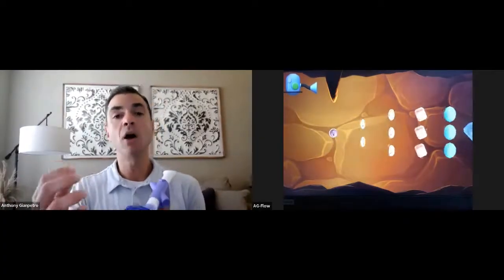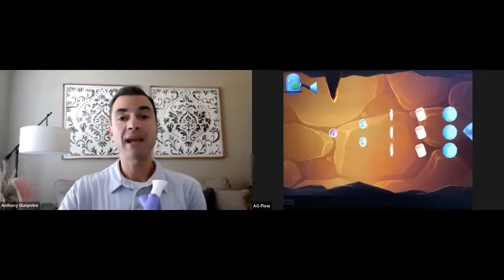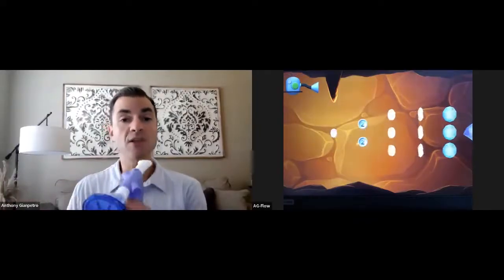Okay, so part of this is helping the patient understand not just volume, like how much air did you get in, but also can you control the flow? We want it steady and easy over time. And that's very purposeful to allow the patient to reduce or prevent atelectasis, to maximize their ventilation. So you would want to encourage them for the next set, please breathe harder and then keep it steady so you can collect all the coins. And this is what it would look like.